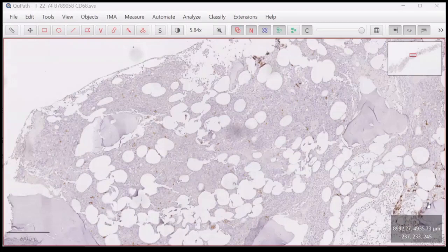One is cellularity. If the cellularity in the post-induction marrow remains hypocellular, for example, what causes the hypocellularity? Is it residual disease, or is the marrow actually regenerating? If they become normocellular, is there any residual disease? So say, for example, you have 10 marrow spaces and suddenly only 2 marrow spaces appear hypocellular when the rest are already normalized. When it's normalized, what is the percentage? That you can semi-quantify.